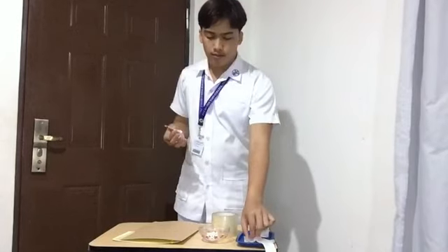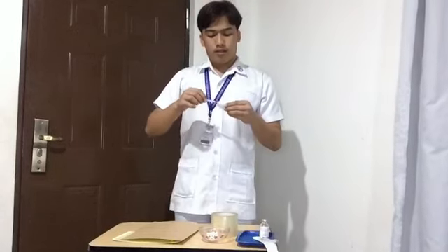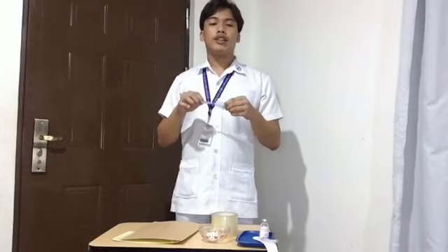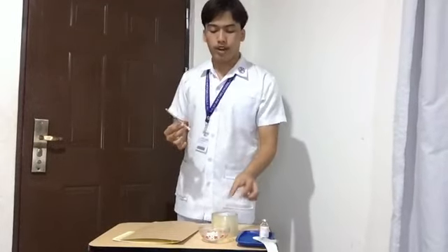So ensure that the needle is firmly attached to the syringe. Okay, I am going to discard this.